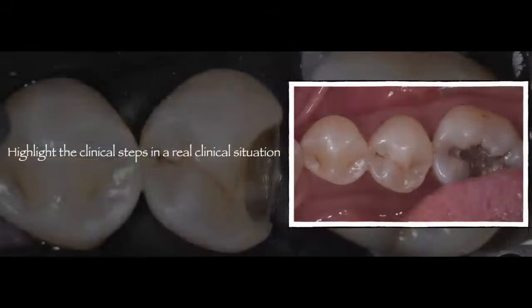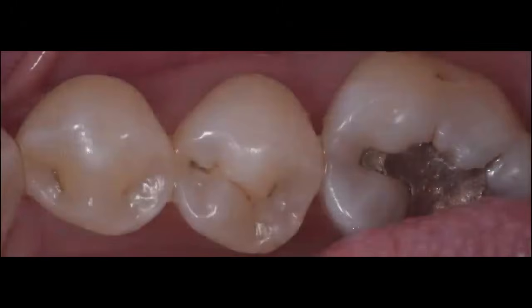So now let me go ahead and highlight the clinical steps in a real clinical situation, so that you can see how I am using, and what I recommend you use today, for your deep margins. Now I'm trying to stay away from using a Tuffle-Meyer band, or a modified Tuffle-Meyer band, or one that I modified myself. I'm trying to stay away from the saddle bands. I'm trying to simplify this and give you one clinical solution for every case out there.